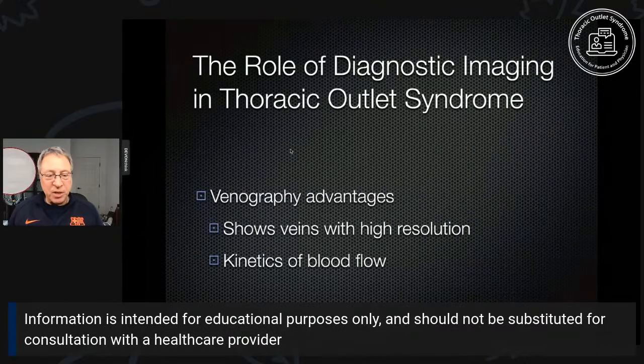So what are the advantages of venography? Just like with arteriography, they show the veins with high resolution because we're pouring this dye or contrast into them.